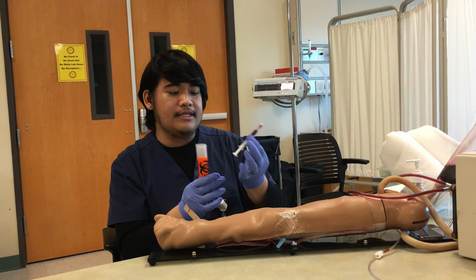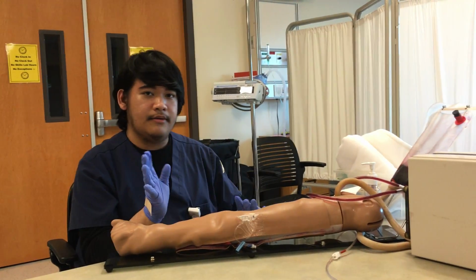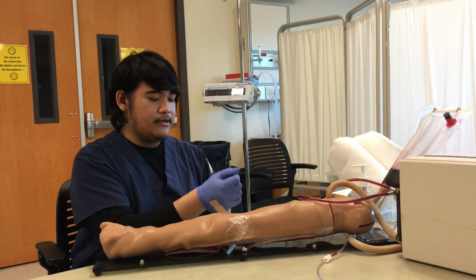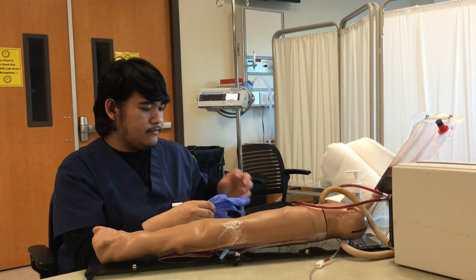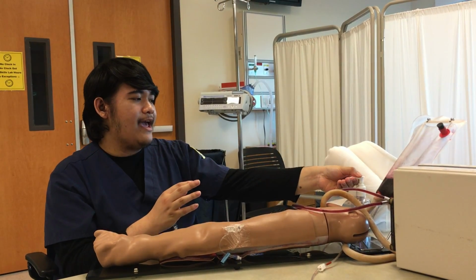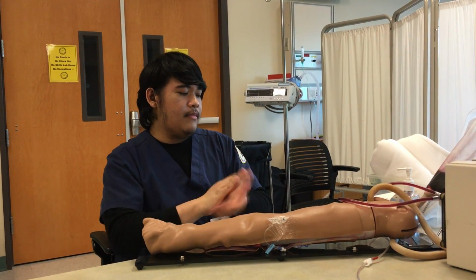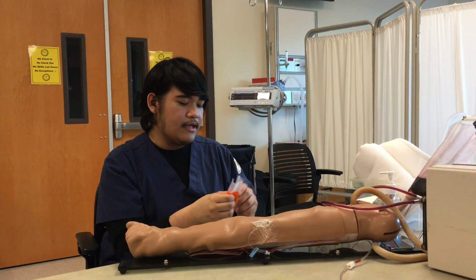Now that this is in the biohazard bag, I could toss everything away. Toss this in the sharps container. Take off my gloves. Wash my hands. And then make sure that I run this into the lab.